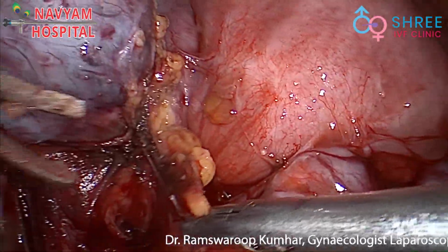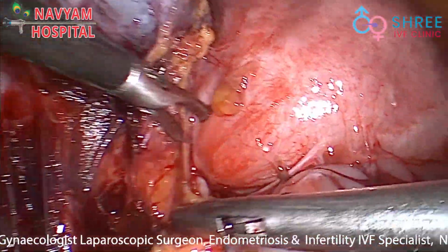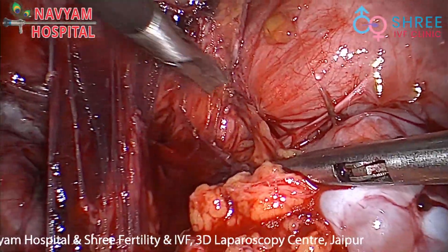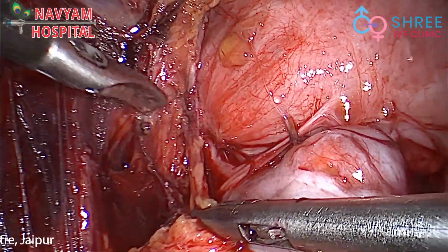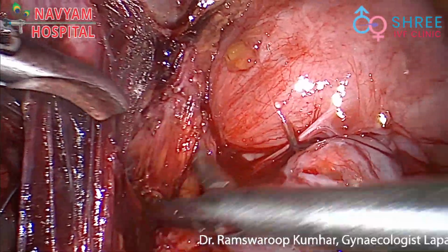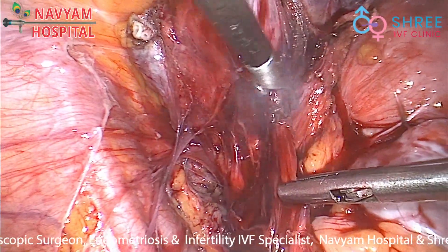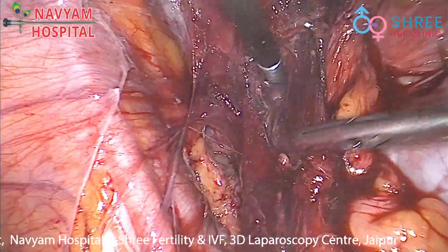Then the remaining bowel was dissected with short bursts of cutting current as well as blunt dissection. But here the dissection should be very gentle, and the traction given by the needle holder is also very gentle, so as not to damage the bowel. Then the remaining fibers of the tubo-ovarian mass were dissected to release it from the lateral pelvic wall, and the ureter was dissected away from this mass in a very gentle manner.